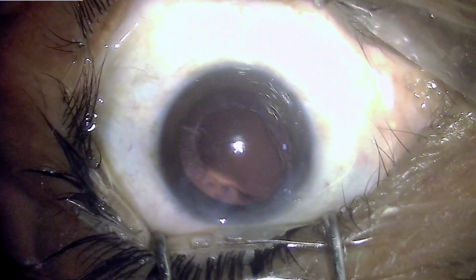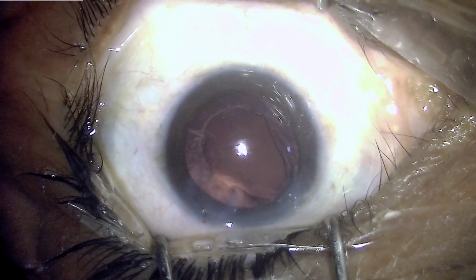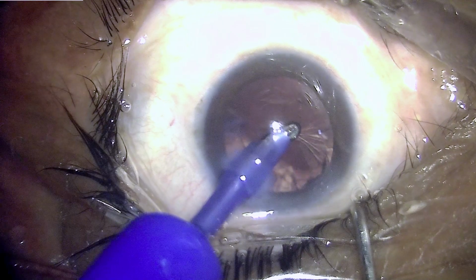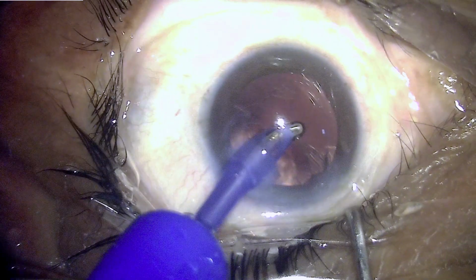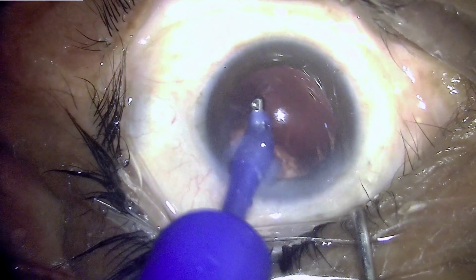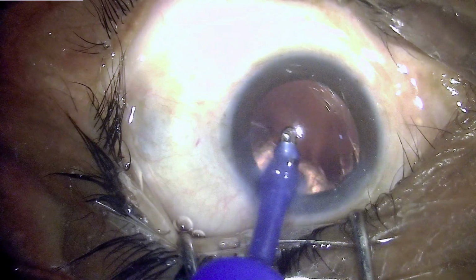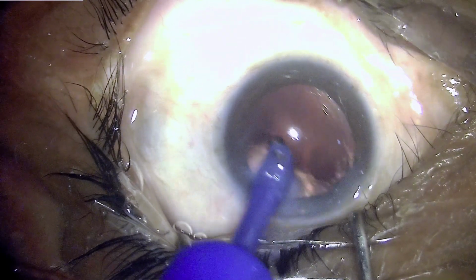However, the damage has been done. So this is one situation where you can have a posterior capsular rupture just because the chamber collapsed and the PC stretched towards the cornea and was damaged. However, in this situation I can also see that there is no vitreous disturbance, so I could proceed with my cortical aspiration, thinking that I should be able to remove this cortex successfully without disturbing vitreous, avoiding the area where the posterior capsular tear is, so that the vitreous doesn't get hydrated and there is no prolapse of the vitreous.